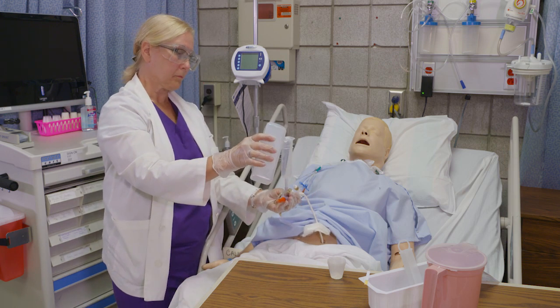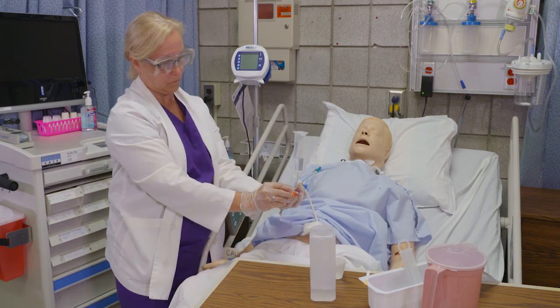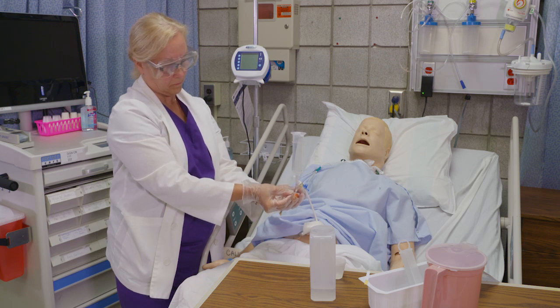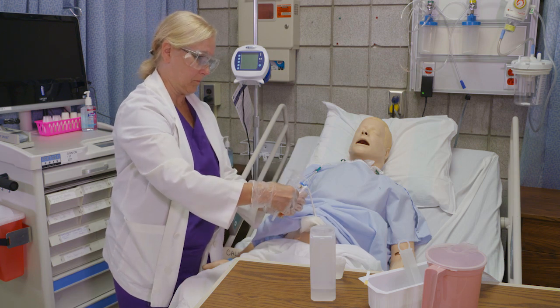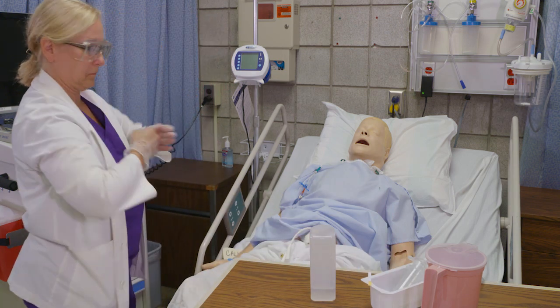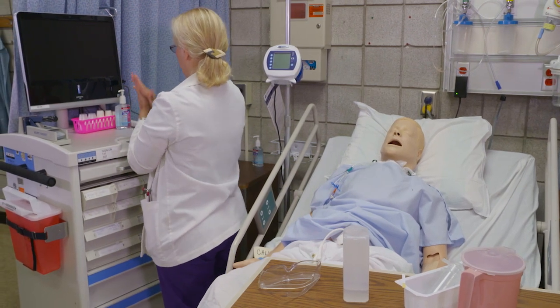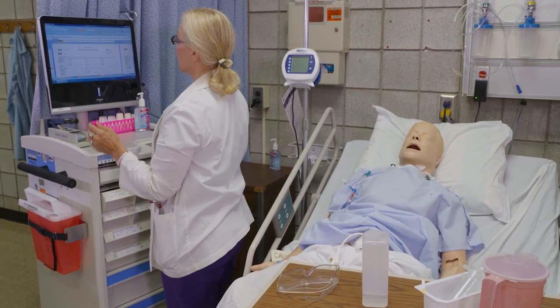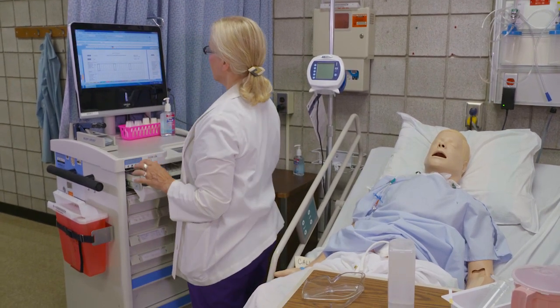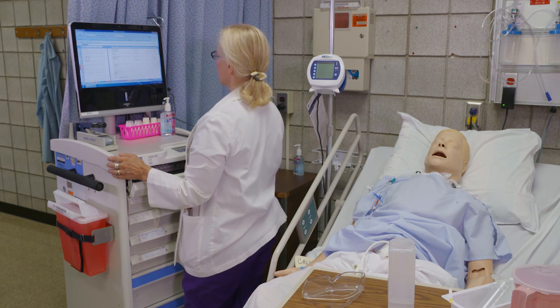After all the medications are administered, then flush the tube with 30 milliliters of water. Close the stopcock to the off position. Remove gloves and goggles. Perform hand hygiene. Complete documentation of all medications and signature at the bottom of the page with the time 0900, signature Sharon Polano, SN/NCCC/SP to identify your initials.